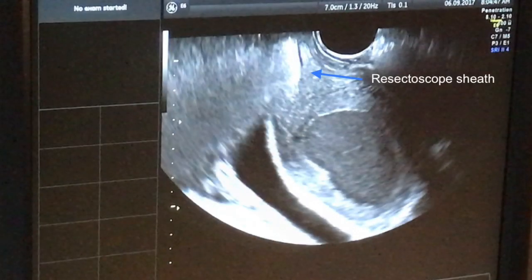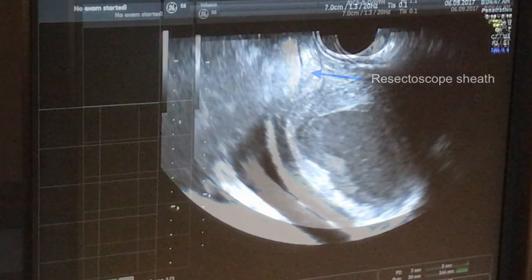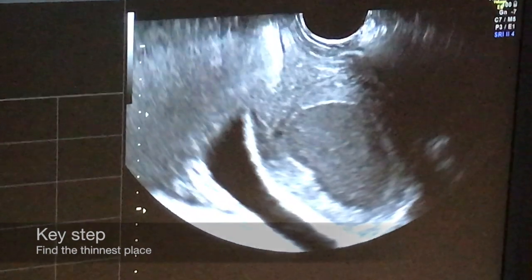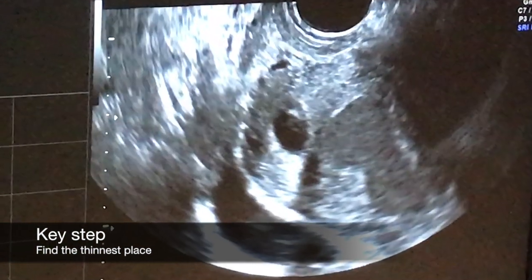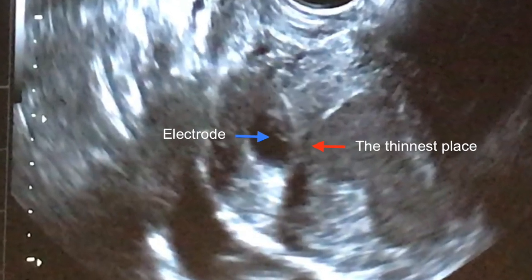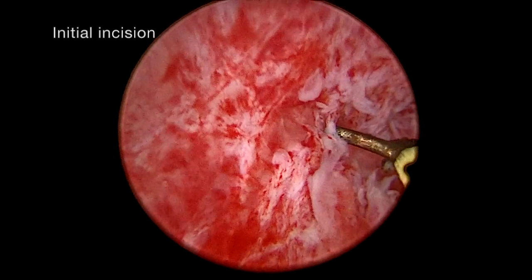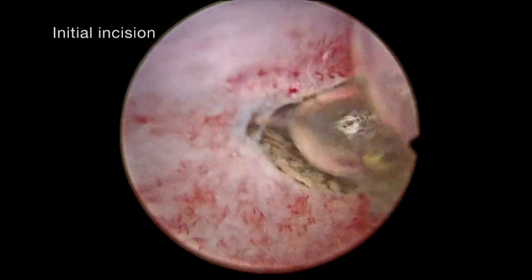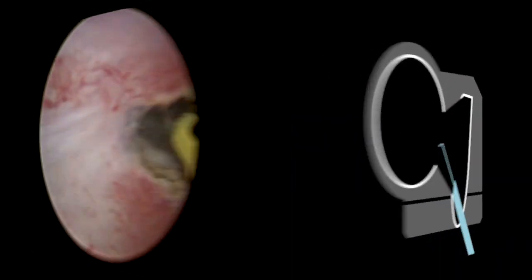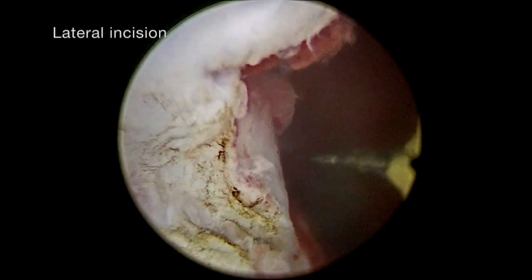A conventional transvaginal ultrasound probe, oblique hysteroscope, resectoscope, and Collins electrode are the basic equipment. The key step is to find the thinnest place of the septum and determine the position of the electrode. In the next step, the initial incision is performed. A connection between cavities is subsequently enlarged by lateral, midline, and fundal septum incision.